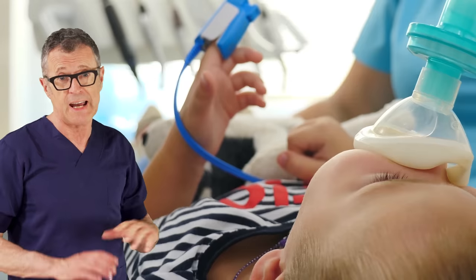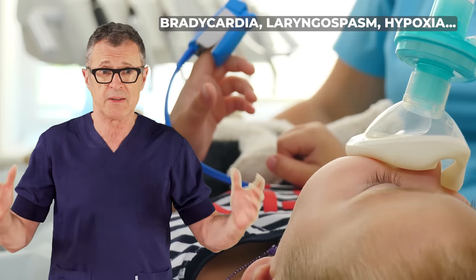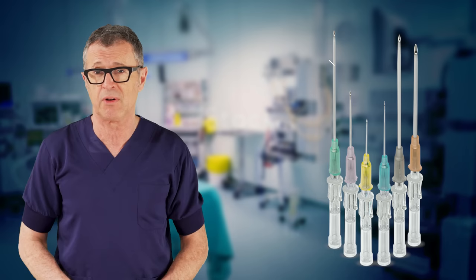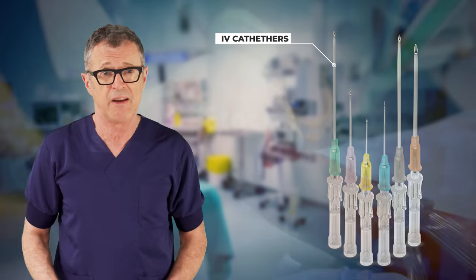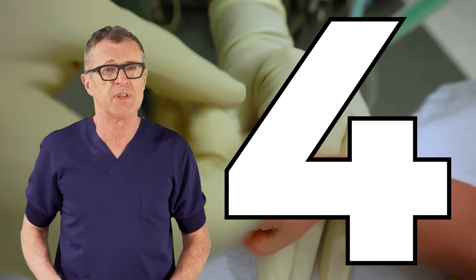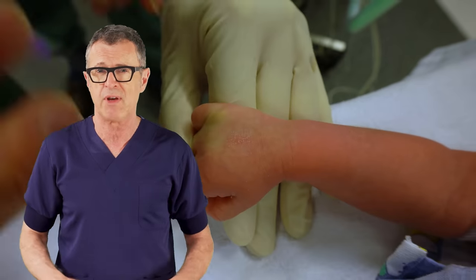During the induction of anesthesia anything can happen — bradycardia, laryngospasm, etc. — and in some cases securing a peripheral line can be extremely difficult and stressful for everyone involved. If this happens in the operating room it can be a really bad start of the day. In this video we are going to share 4 important tips that will substantially increase your chance of securing an IV in a baby.